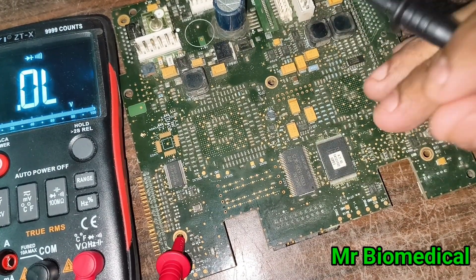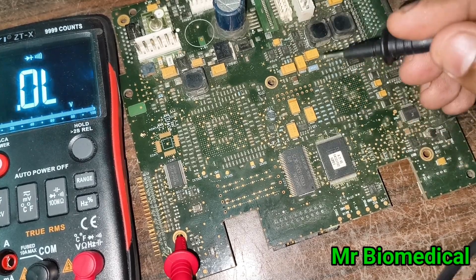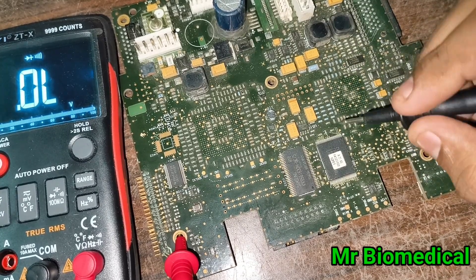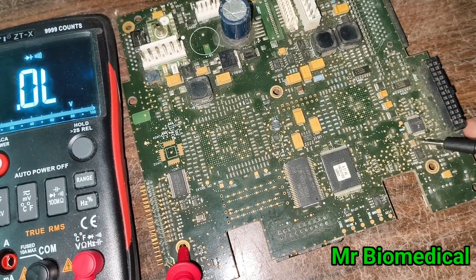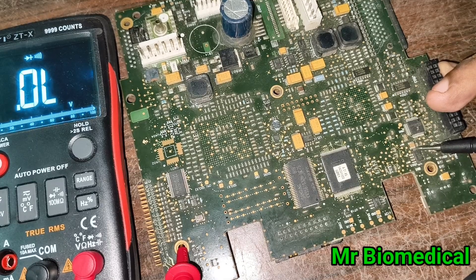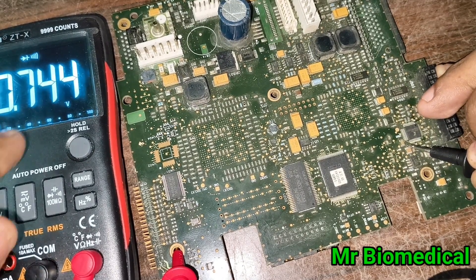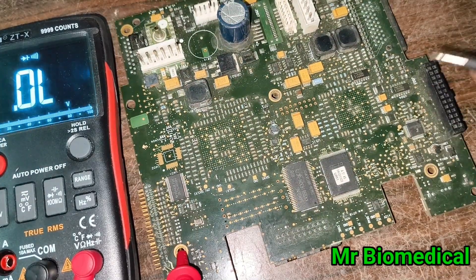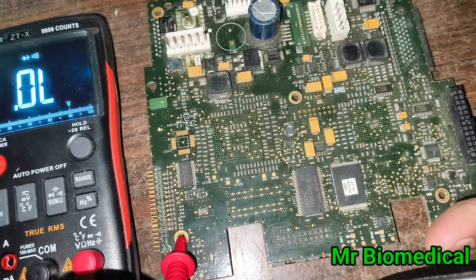This board doesn't have any problem, but I'm showing you how it looks. Let's start with the capacitor. Capacitors are connected on one end to ground and the other end to the positive line. You can easily check like this — reading 0.744, which is good.